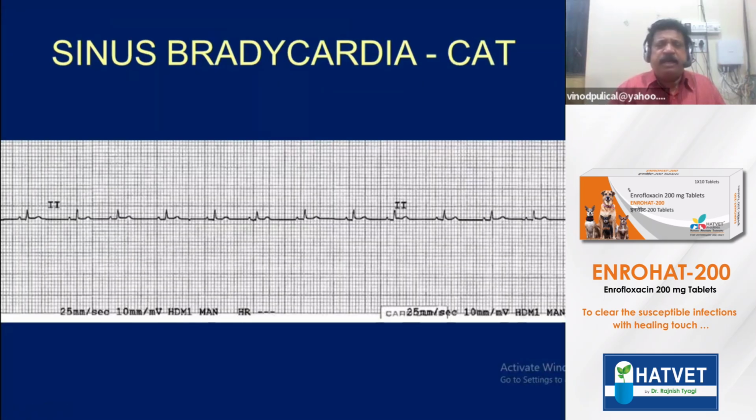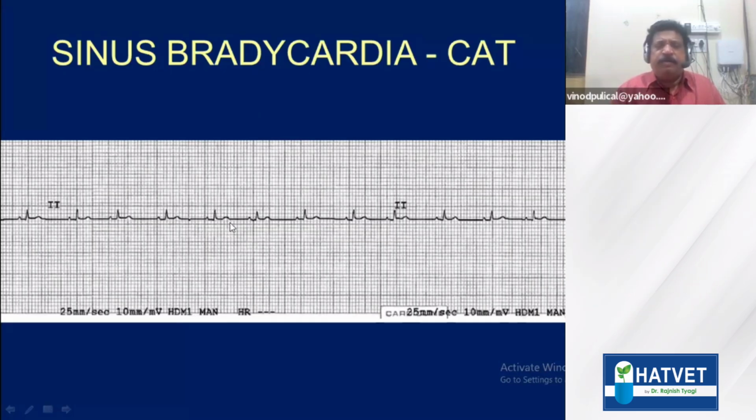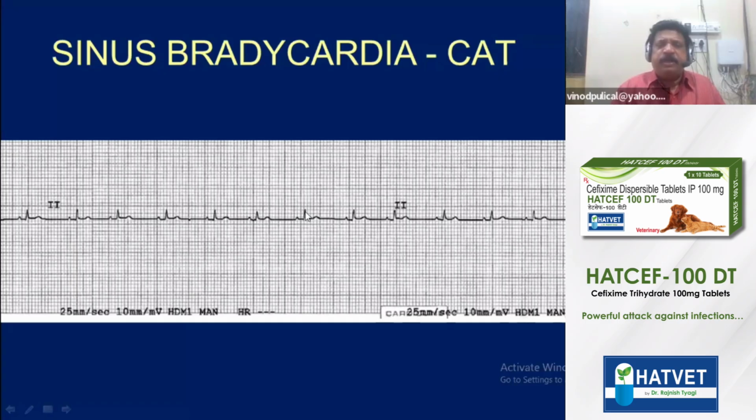Sinus bradycardia in the cat. See, I already mentioned that the sinus complexes of the cat will normally be very short. In this sinus bradycardia, you can see the long RR interval in this cat.